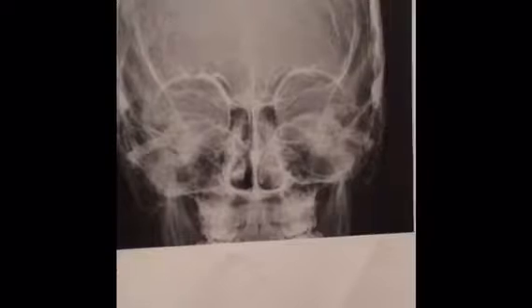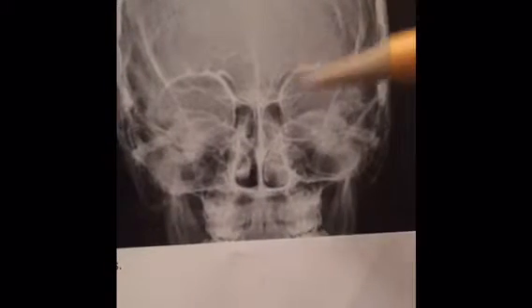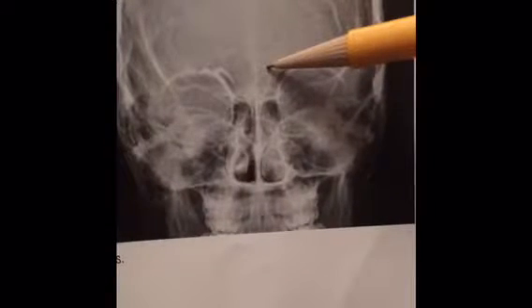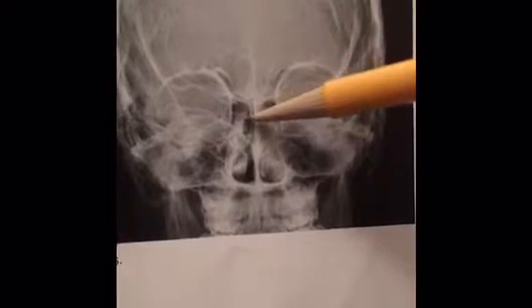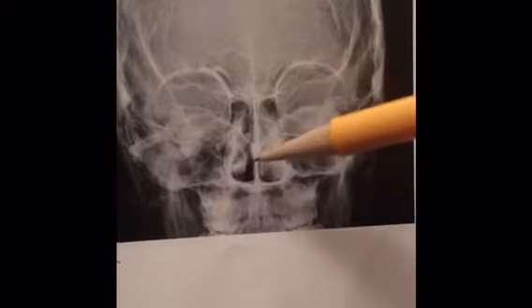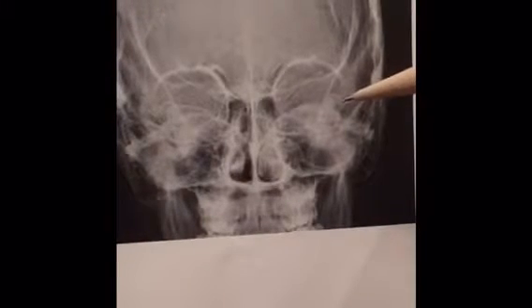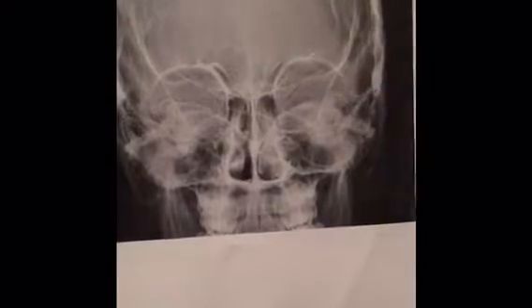And some of the structures that you're going to see in this projection are going to be the frontal sinuses, which are here. You're going to have the ethmoid sinus, the anterior, which are here, and then you'll have the sphenoid sinuses, which are here. And then you have the petrous ridges lying in the lower third of the orbits.